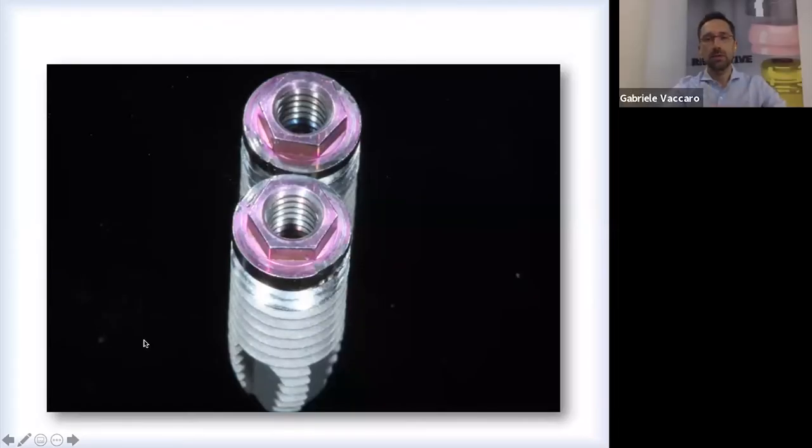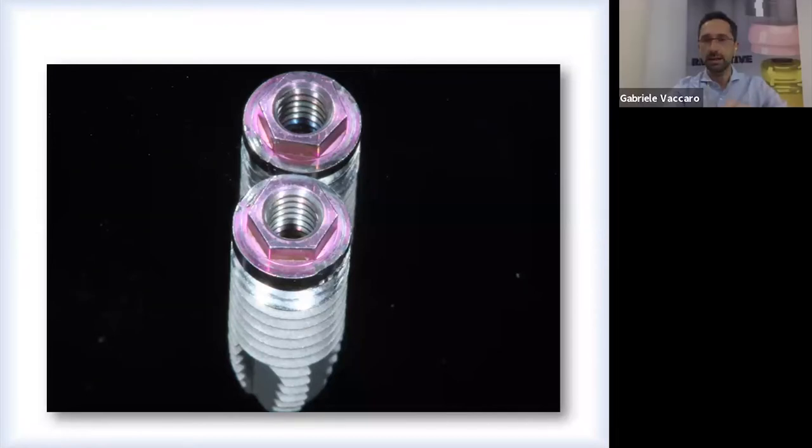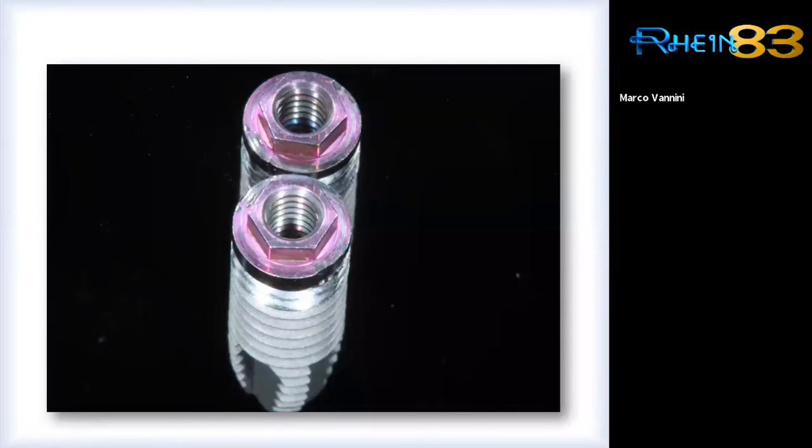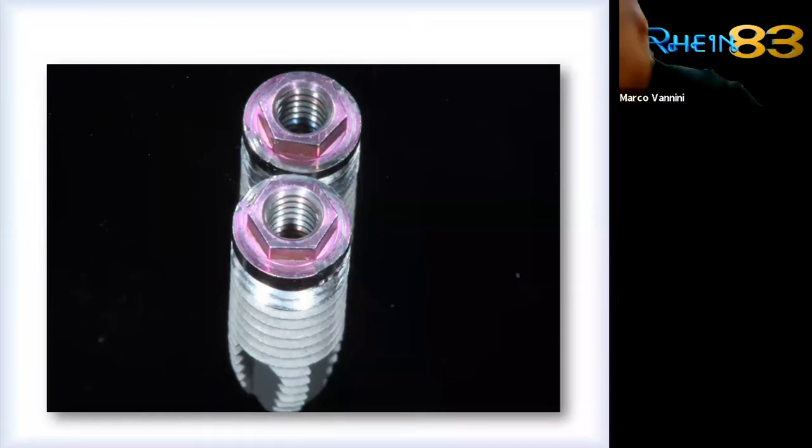Now let's talk about how the implants are connected with the teeth, because this is the strong point to fix once we talk about fixed prosthesis, especially when we deal with more than one fixture.